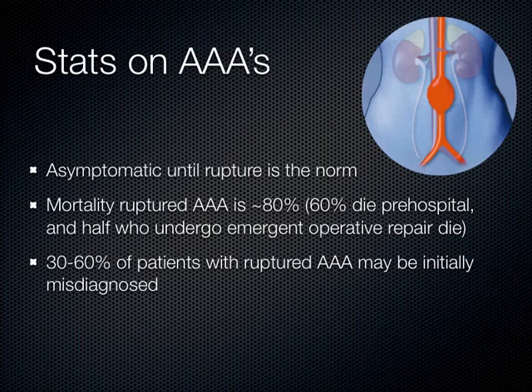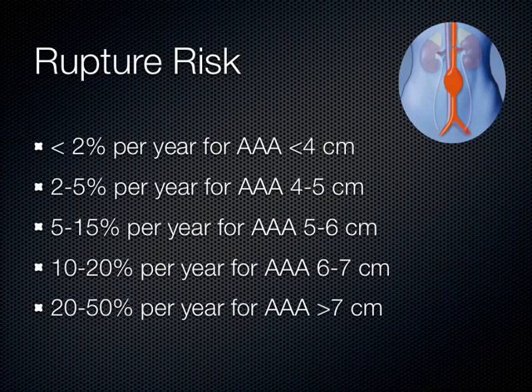Because most ER doctors to this day still don't do bedside ultrasound, right? And so they go straight to CT. I'll get to that. So they do a CT scan, and he's got a 10 centimeter abdominal aortic aneurysm, when a normal size aorta is less than 2 centimeters. It's leaking, okay, on Coumadin.